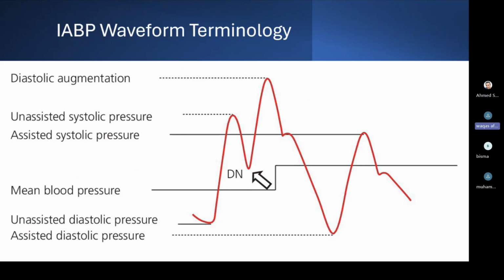Yes, Doctor. And this is the same waveform that we use when adjusting the timing of the IABP inflation and deflation. Yes. We adjust in a 1:2 ratio and set the reference line according to this waveform, and inflate or deflate according to this. Yeah, and if the timing for the deflation is prolonged, that means the patient is having late deflation.